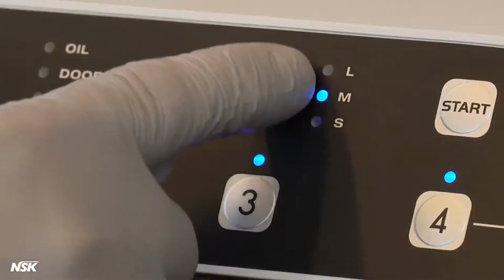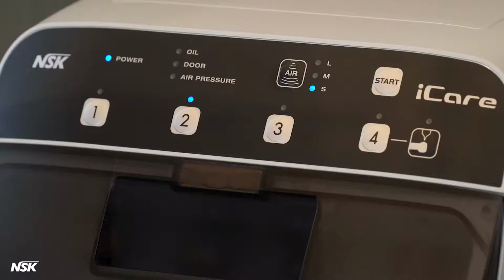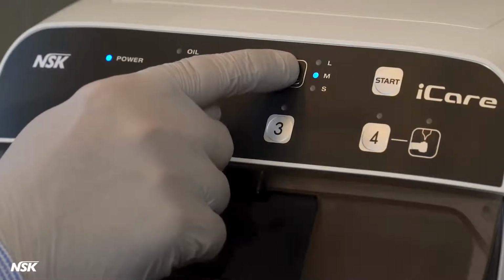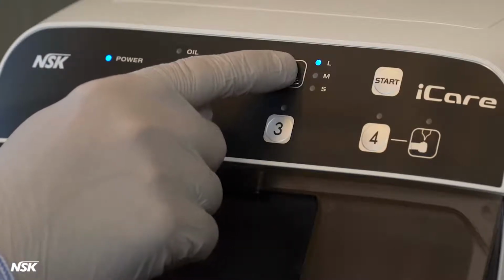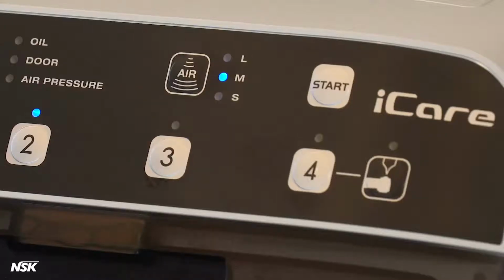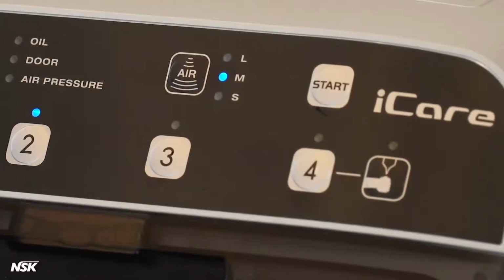Air Select button. This button selects the length of the air purging period in each lubrication cycle. There are 3 options. S is for high-speed air-drivens only. M is for a combination of high and low-speed air-drivens or a combination of air and electrics. This will be used most frequently. L is used only in rare cases where you notice some excess oil in handpieces after normal operation. Start button. Once everything is set up and ready to go, this button starts the lubrication process.